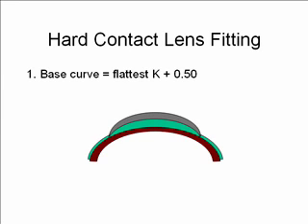This is definitely a don't try this at home lecture. This is fitting hard contact lenses as described in the textbooks, but not a method I would particularly recommend for actual real life patients, or at least one to be used in supplement with other fitting practices. But let's deal with the optics portion of this.